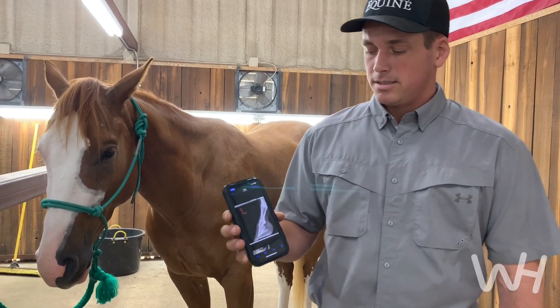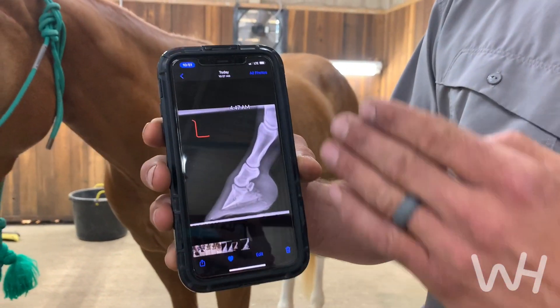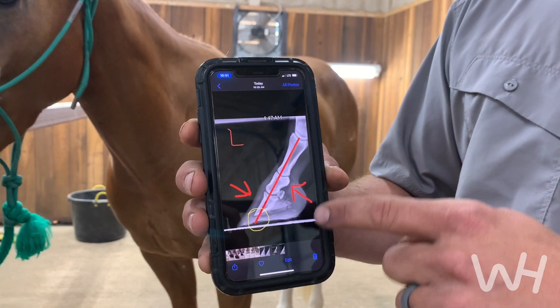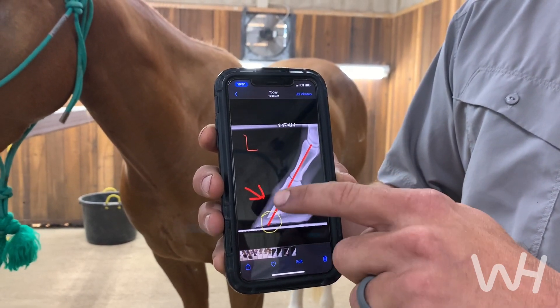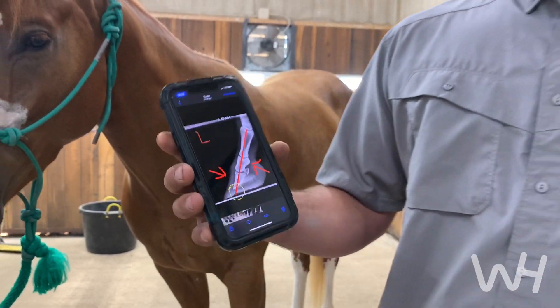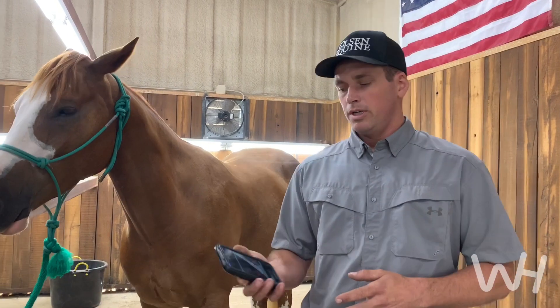At first glance it looks pretty nice, but if you look a little farther, this horse has excessive heel and an upright foot, and what it does is pushes P2 that way and the coffin bone this way. The problem is there's not a lot of sole depth, so you can get in a lot of trouble on this horse if you're not careful.